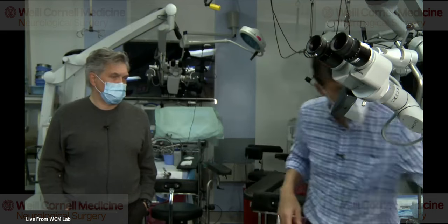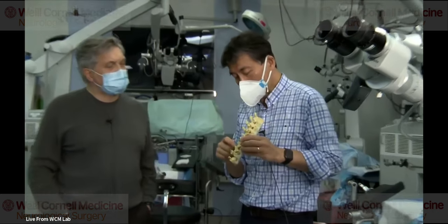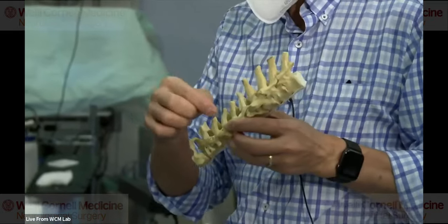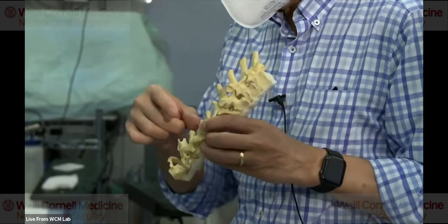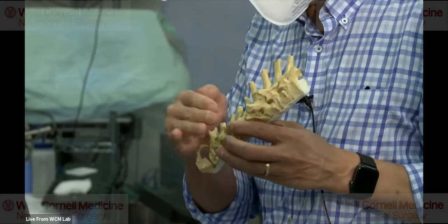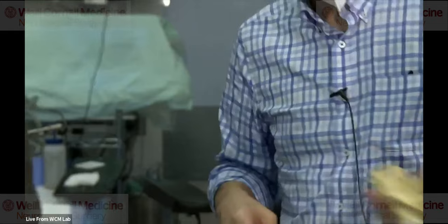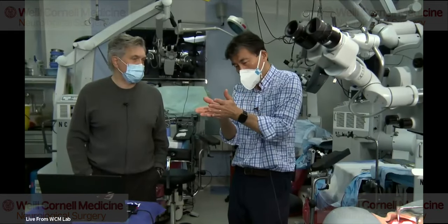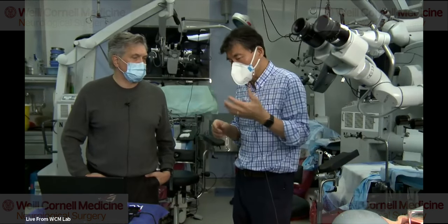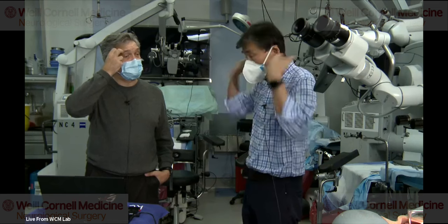And another thing that you can do is you just leave the muscles attached to the bifid spine and you do an osteotomy where the bone is left attached to the muscle and you just cut it and let it fly. And then you tag it with a suture. And that way you're closing bone to bone as your first layer. Then you take the little fascia, and if you've done a very meticulous dissection, the muscles are still enveloped in fascia. You take the fascia and you take tiny little bites. That's why you take so many sutures. And then you distribute the force across and you close one layer, then the next layer, then the next layer, then the next layer. And if you do that, it really does make a difference in postoperative pain. And also cosmesis.